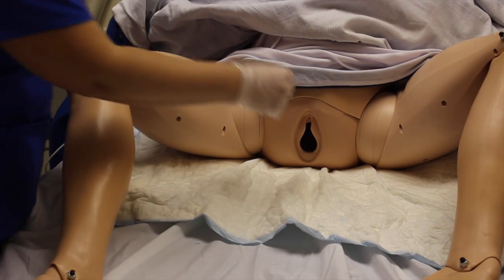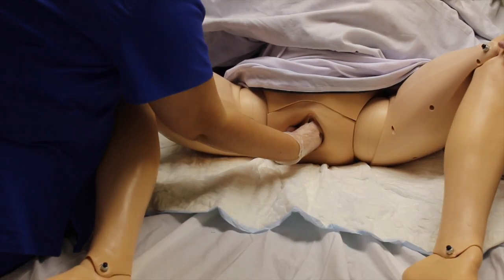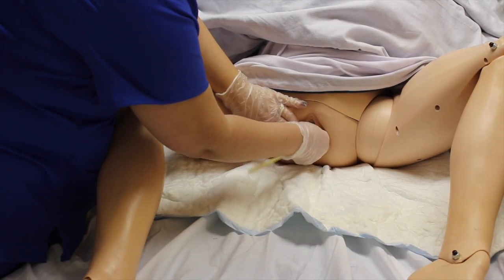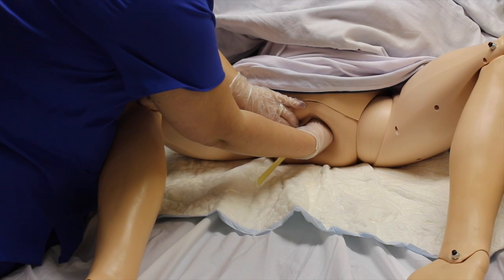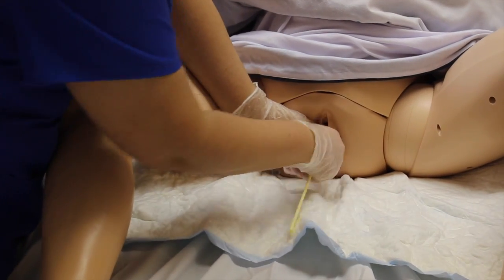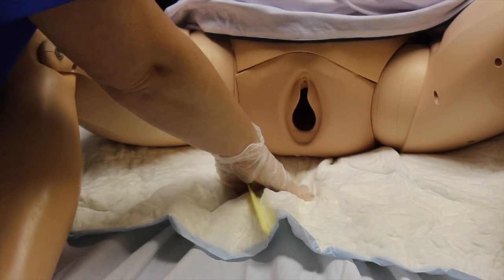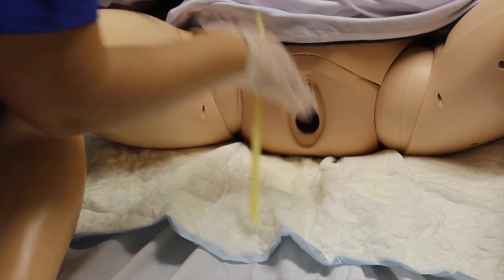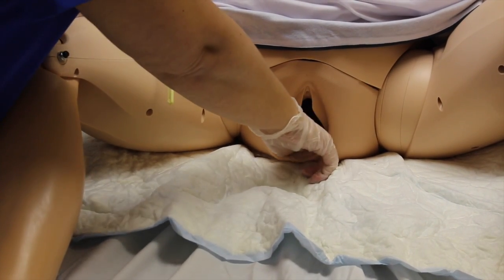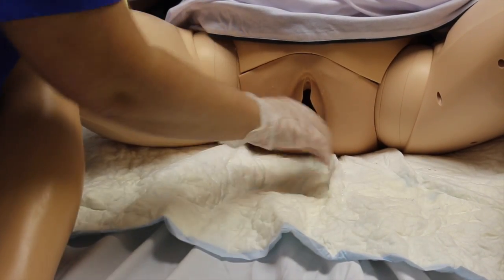To do a vaginal exam, they check the cervix, which our patient is about 5 centimeters based on what's going on in here. And they gently insert the amni hook, in which you'll see a trickle of fluid come out. And it's continuing to come out, and it will continue to come out throughout the labor process. You have to change the chucks pads fairly frequently in order to keep the patient dry.